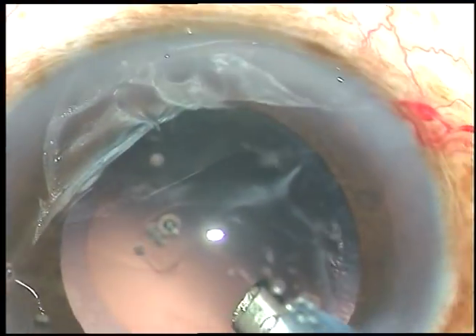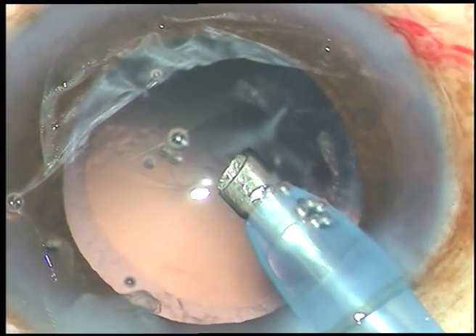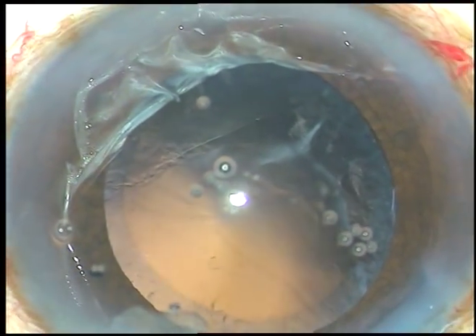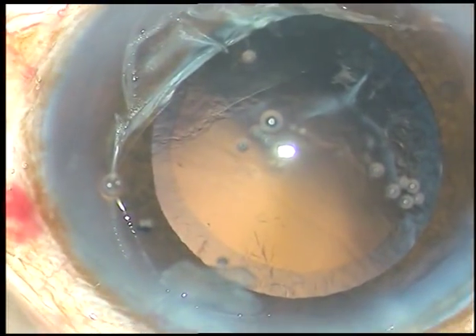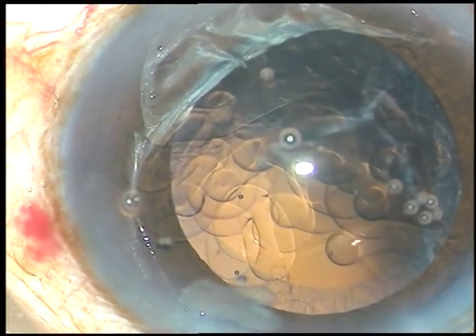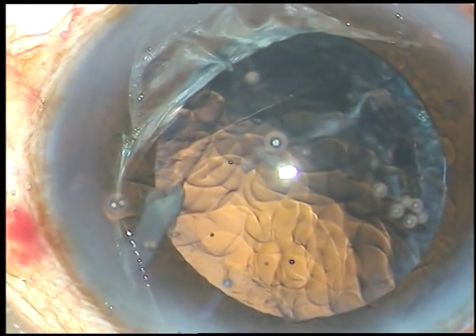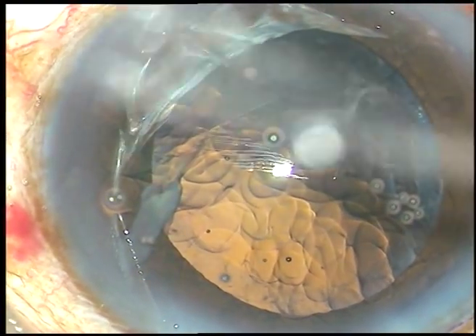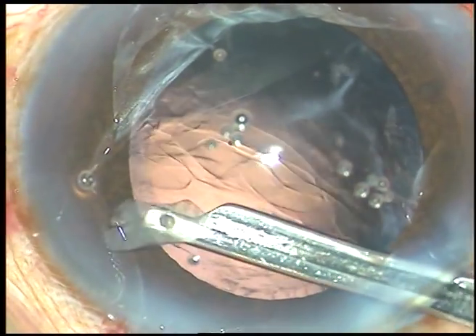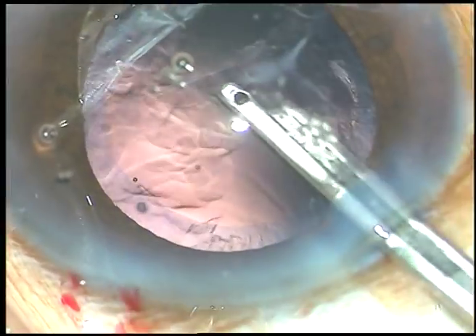Yes, the nucleus has been managed. See this piece of nucleus — it is also removed. Now, viscoelastic substance is injected. Some epinuclear material is near the left side port and we have to remove it first before removing other cortex. So, I introduce the Simcoe and bring this epinuclear material out of the anterior chamber.